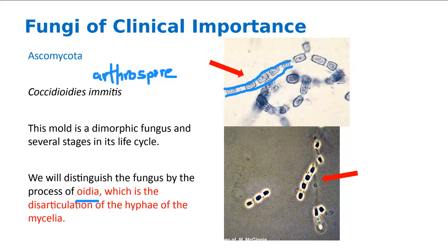That's correct, Amenria. Each of the arthrospores is an individual hypha. That's correct. Anybody else have any other questions?